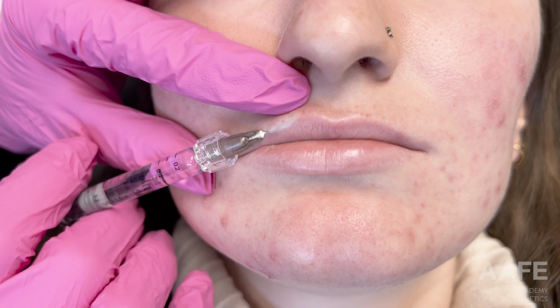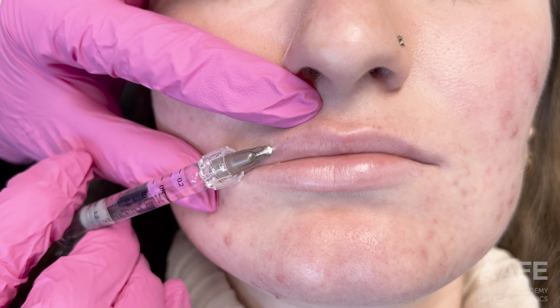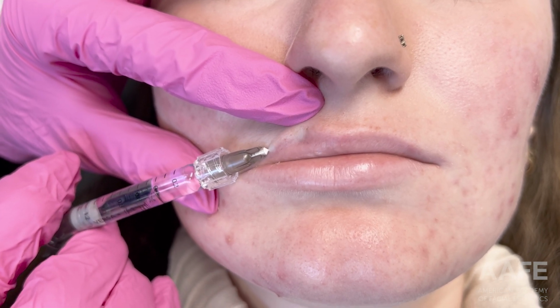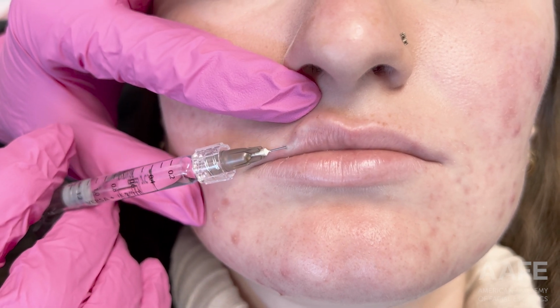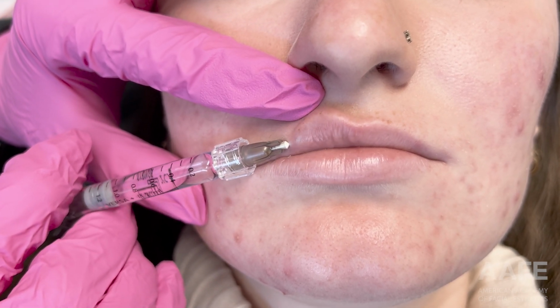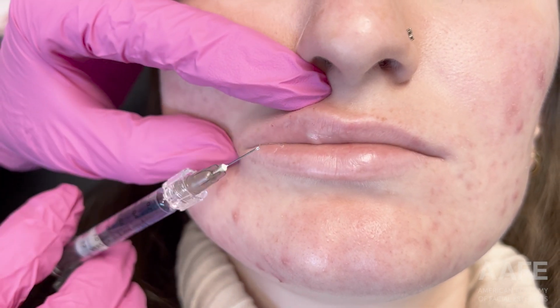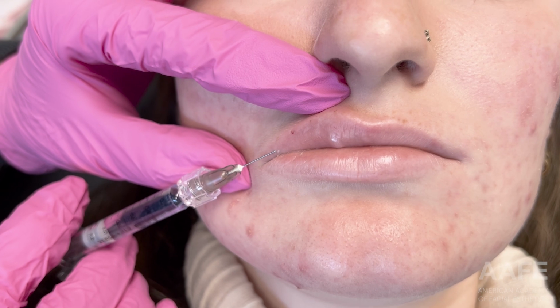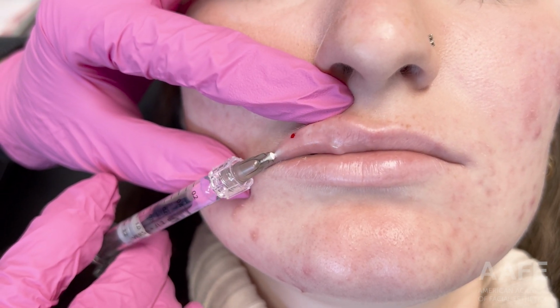We have a wonderful new patient in the chair today. We're going to do some lip filler and some neurotoxin. You can see here we are starting with the lip filler, and this patient has been cleaned off really well. I did remove her makeup and use some alcohol to clean the site. I am going in with a medium dermal filler and really just enhancing these beautiful lips that she already has.